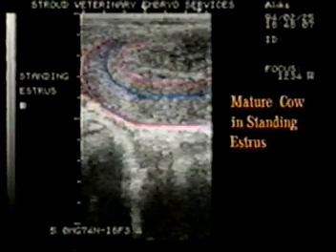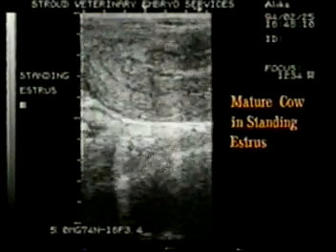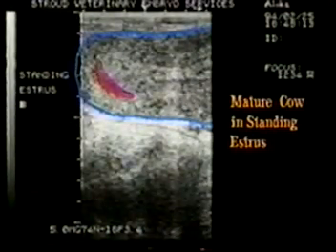During diestrus, this non-echogenic uterine lumen is usually not visible due to a lack of intraluminal fluid. When a cow is in estrus, it is normal to find pockets of luminal fluid in the region of the greater curvature, which shows up as black non-echogenic areas. The red color here highlights such an area. The myometrium of an estral cow is more thickened than when in diestrus.